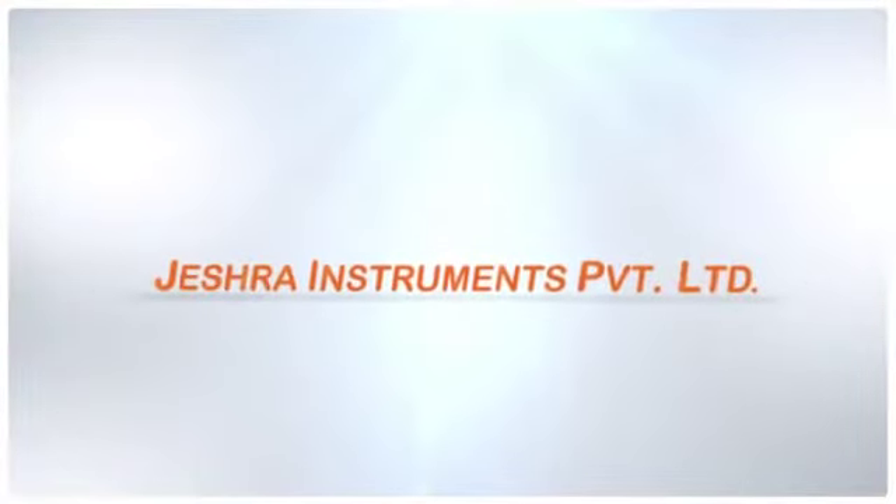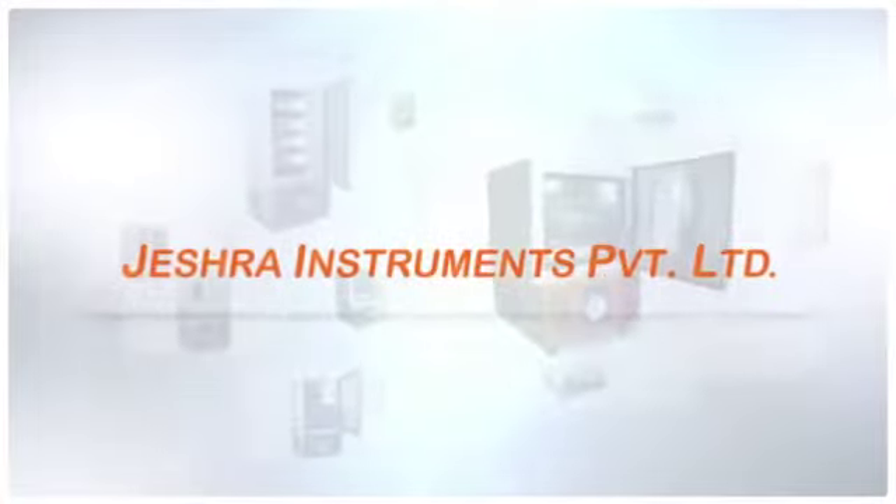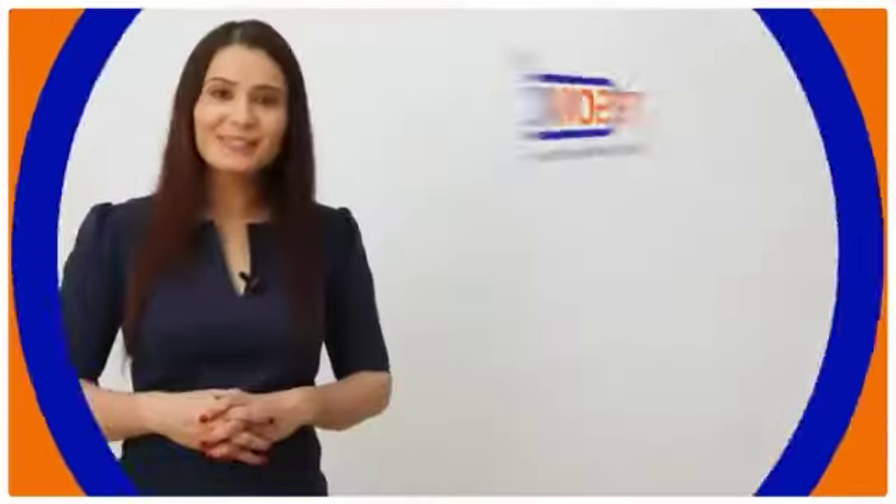Hello everyone, welcome you all to Jeshra Instruments Private Limited, one of the leading manufacturers of blood bank equipments. Presenting to you, Tecsonic Blood Bank Refrigerator.